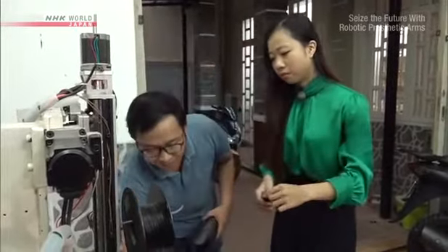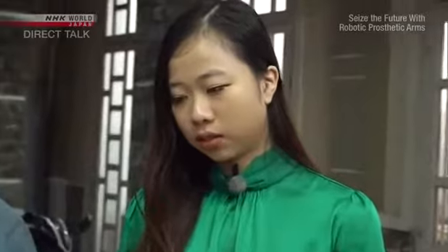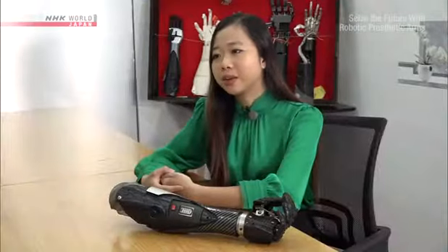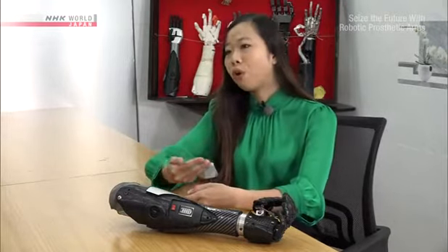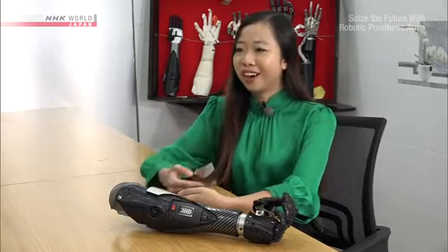Ha's next goal is to create a prosthetic arm that can fulfill the needs of each and every disability. We also talked to a lot of female amputees, and we realized that for women there is a very different challenge in daily use, especially if you have a baby. So we're thinking about developing a module for looking after the baby, because right now if you are a one-arm mom, it's really hard for you to hold the baby. So we want to have a kind of baby holding arm.